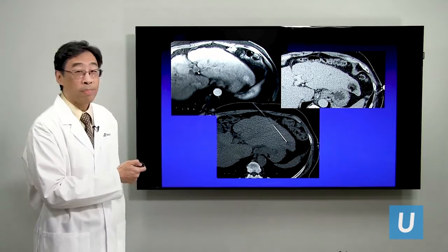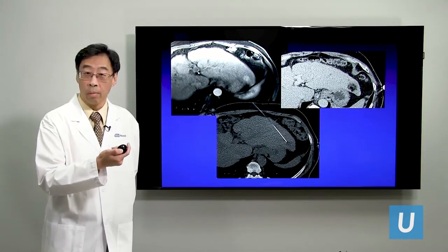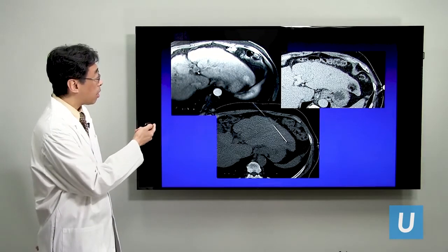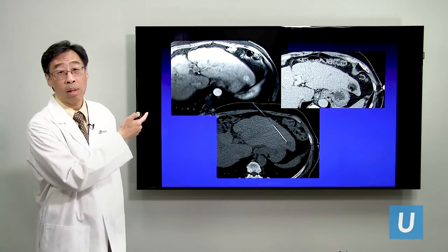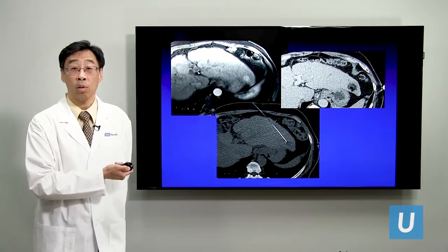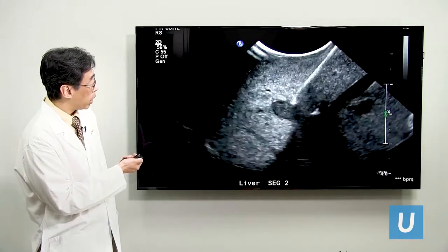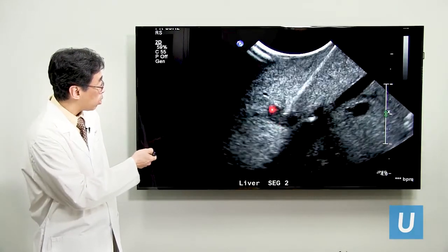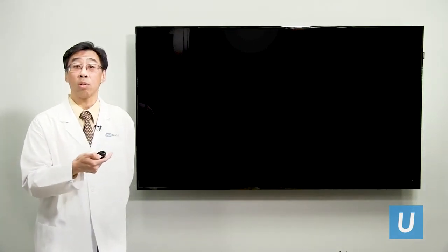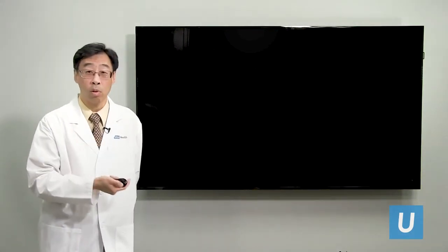So as you can imagine, if you can do this, then you can do anything with the tumor, injecting all kinds of different agents, right? But in this case, we were able to see this small tumor based on MRI and CT. We have other tools that we can use for targeting tumors. For example, in this case, we're using dedicated real-time ultrasound where we can advance a needle directly into this tumor. And you can see how things actually move during the procedure. And this technique allows us to see in real time what structures to avoid and how to navigate directly into the tumor.